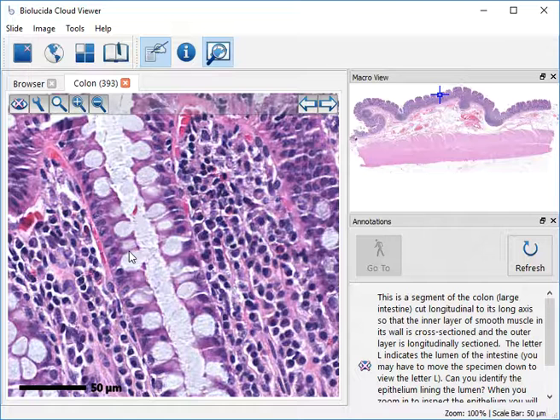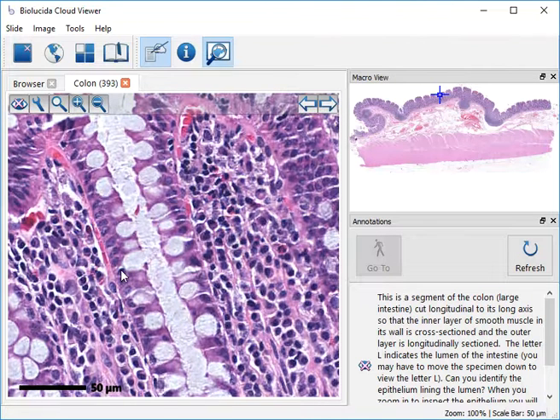And in this case, in the colon, there are lots of cells that are full of mucus and provide the mucus that flows out into the lumen that lubricates the feces so that it can glide more easily in its path through to the outside. So these are goblet cells. And perhaps this one here, where you can see the nucleus at the base and the shape. As you look around, you'll see better examples, but they're shaped like goblets. And if you remember in the lecture, and perhaps in the WebMic, you saw some examples of those.